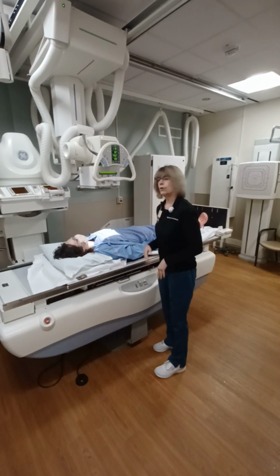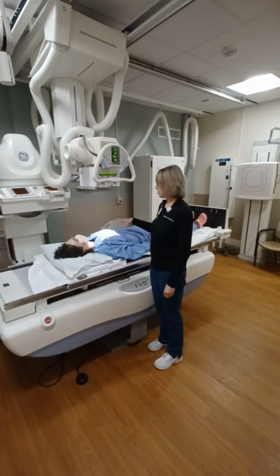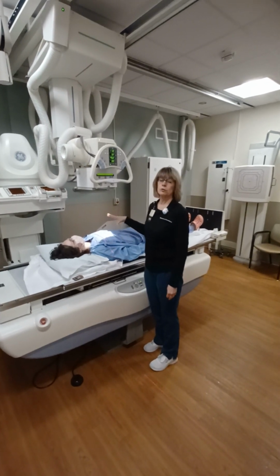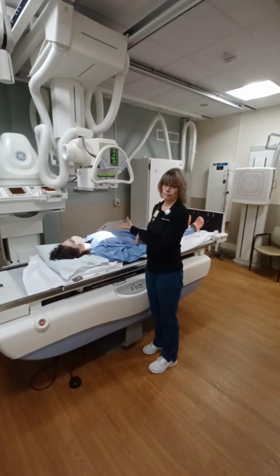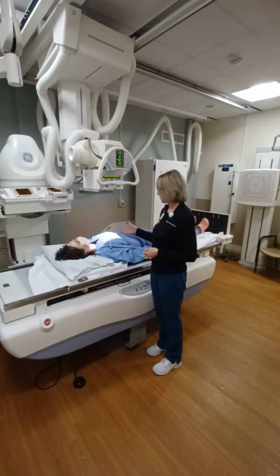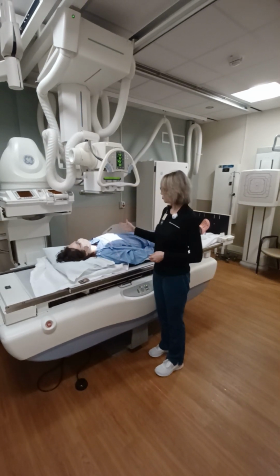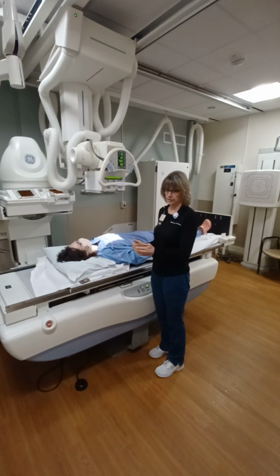All right, now the important part in positioning for a stomach, for the upper GI, is that you have to, number one, know that person's shape of their stomach, where it's located. The average person, known as the sthenic body habitus, the lesser curvature of the stomach is at approximately the L1 level, and that's where you want to center.